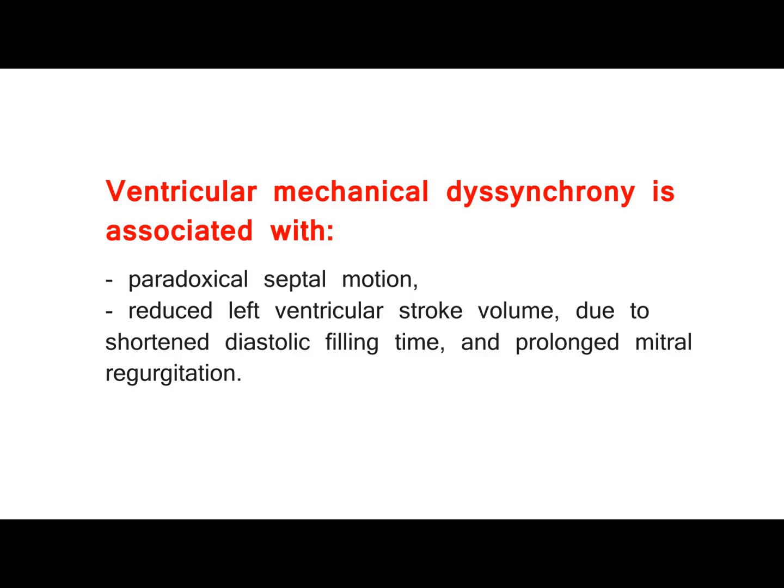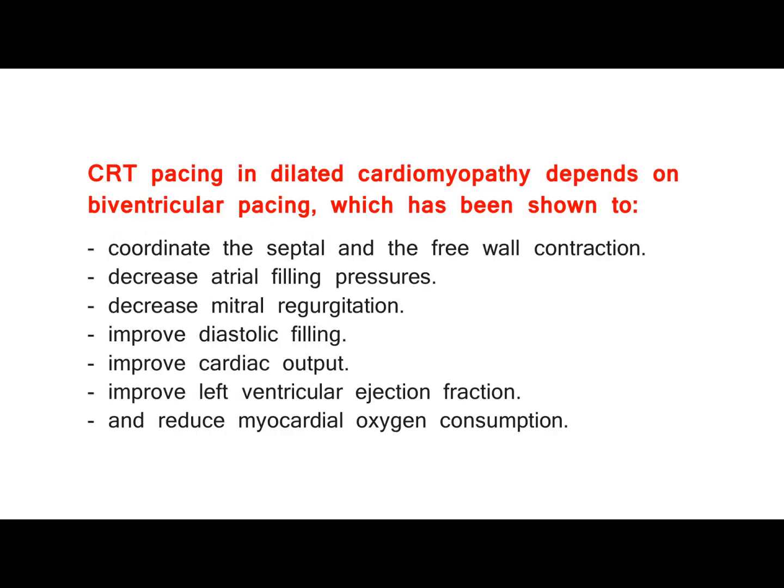Ventricular mechanical dyssynchrony is associated with paradoxical septal motion, reduced left ventricular stroke volume, due to shortened diastolic filling time, and prolonged mitral regurgitation. CRT pacing in dilated cardiomyopathy depends on biventricular pacing, which has been shown to coordinate the septal and the free wall contraction.